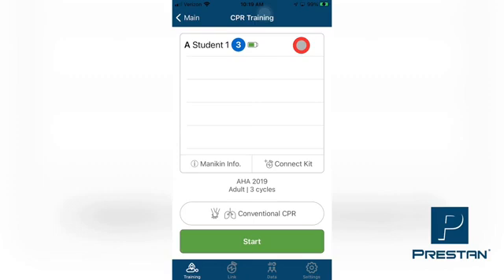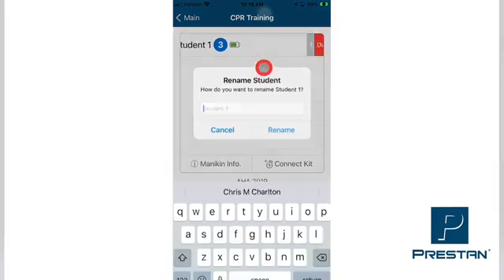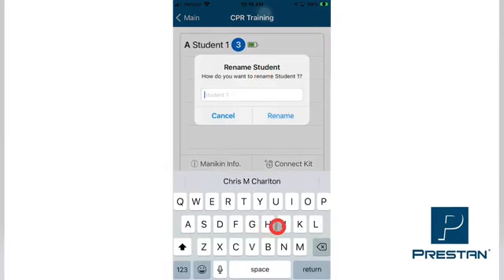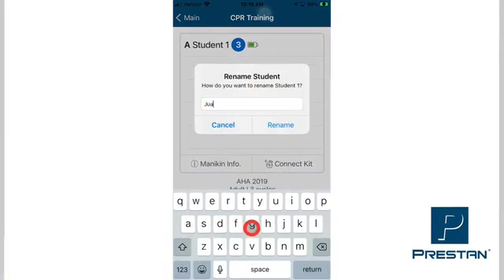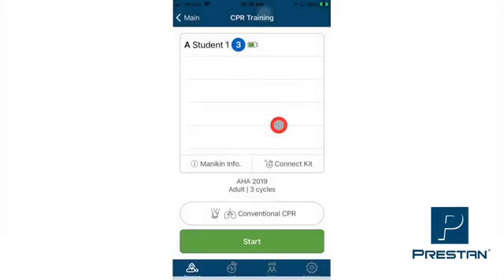Next, press and hold the name of the mannequin that is to be renamed. While still pressing on the name, slide your finger to the left until you see two buttons appear. Note that if you continue to slide your finger to the left, the Rename button will disappear and only the Disconnect button will show. Select Rename. Type the new name with the keyboard that appears in the app. When complete, press Rename. This new name will now appear on the list of mannequins. Please repeat this process for each mannequin that you wish to rename.